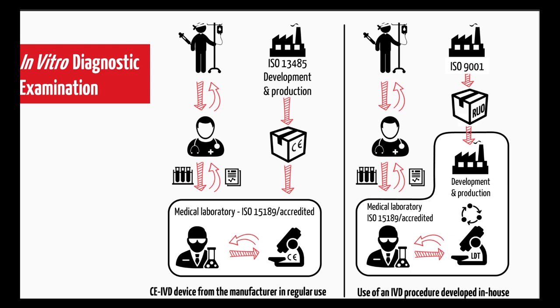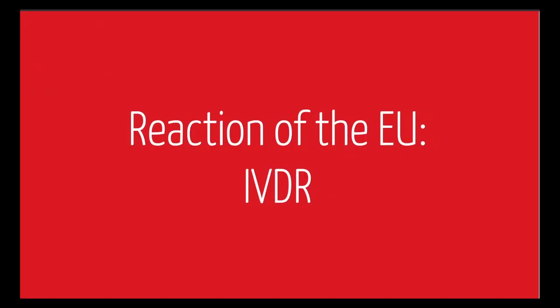And then again, the patient comes to the physician, gets consulted, the sample is sent to the laboratory, analyzed, the result is sent back, and the patient is treated or gets a treatment recommendation. So there is no difference for the patient and for the physician, and they may not even recognize that the product was originally a research use only product. And that is also difficult from the patient's and user rights position.